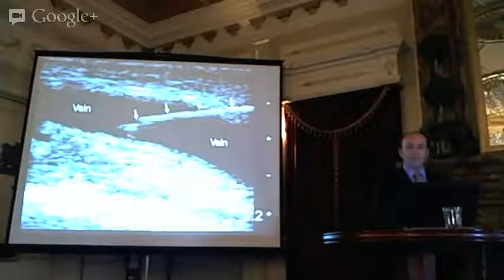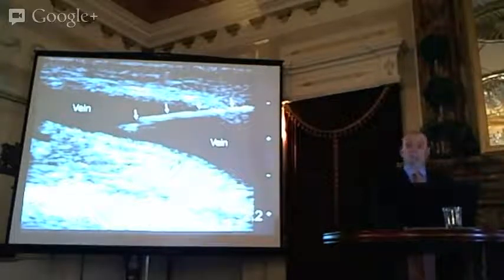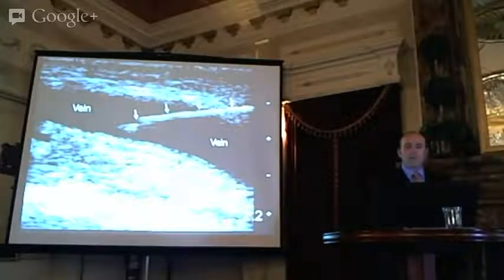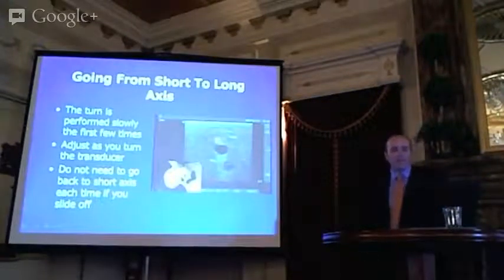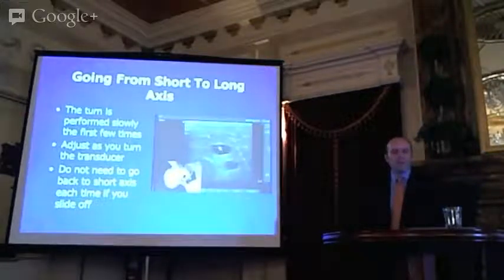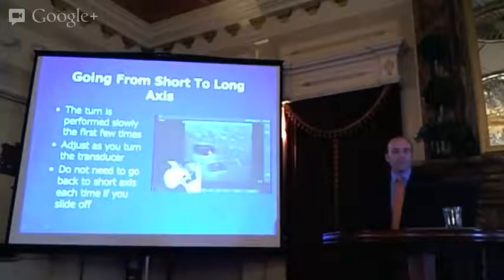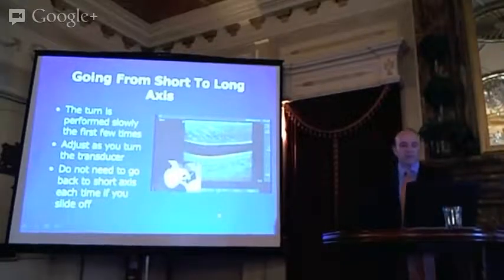In fact, you can make sure that you don't hit the posterior wall in a patient that's about to get TPA, let's say, or a patient that has an INR of 9.0. You can make sure you only puncture the anterior wall. The biggest trouble people have, surprisingly, is that initial turn. And this is kind of simulating what it would be like, if you haven't practiced this a lot, slowly turning your transducer to keep the vein in the center of the screen, elongating it with each turn, and if you screw up, just go back and do it again.